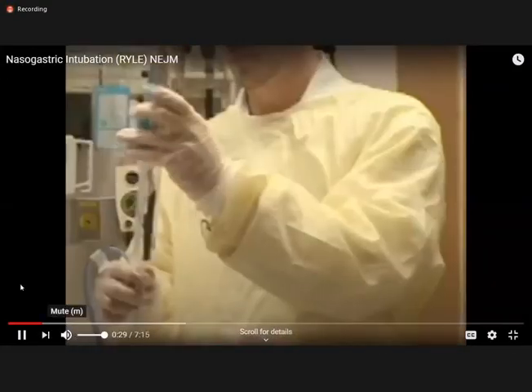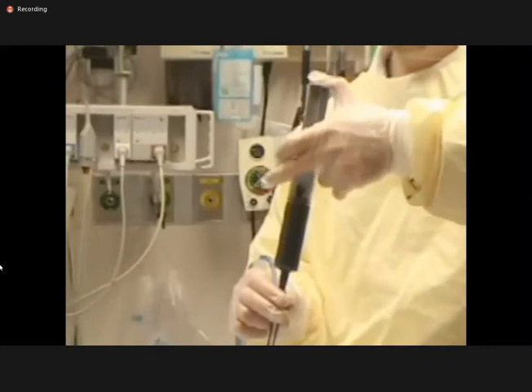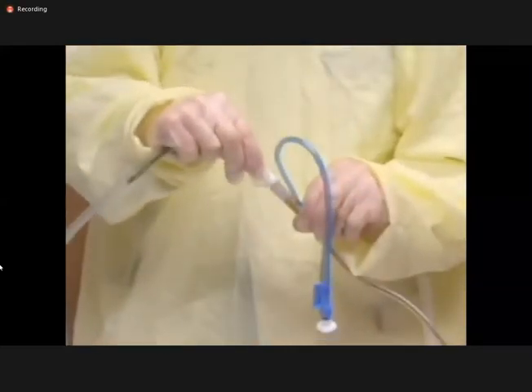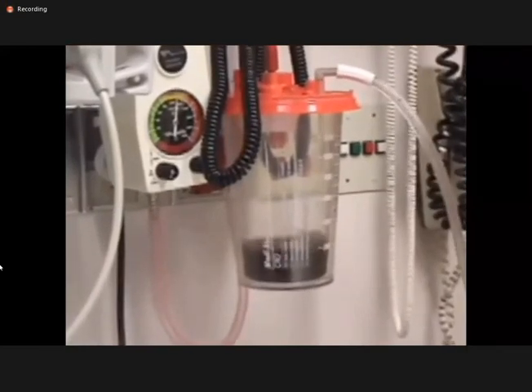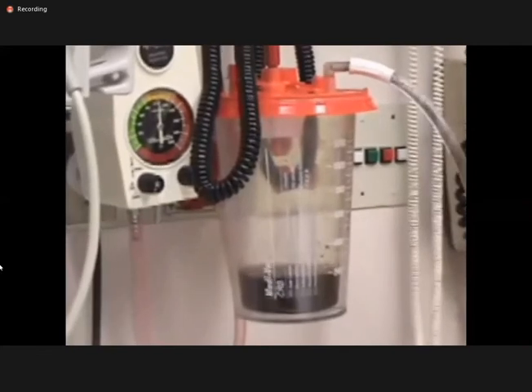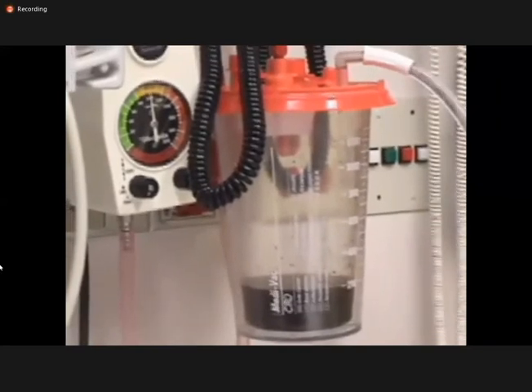NG tubes may be placed as an adjunct for the delivery of oral agents such as activated charcoal or oral radiographic contrast media. NG tubes are often placed in patients with suspected upper GI hemorrhage. However, the sensitivity and negative predictive value of nasogastric aspirates for detecting active bleeding is suboptimal, and the absence of bloody return cannot be relied upon to rule out hemorrhage. Nonetheless, nasogastric intubation may be useful in selected patients.